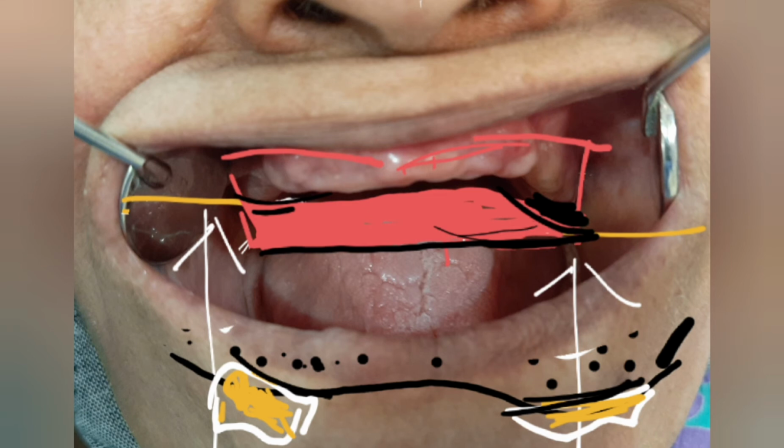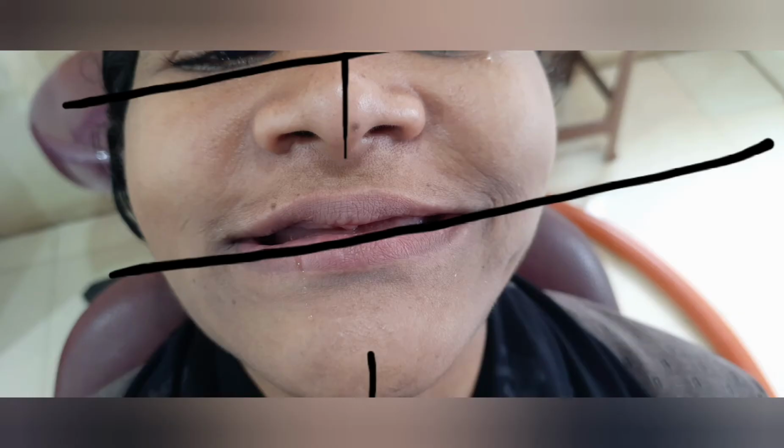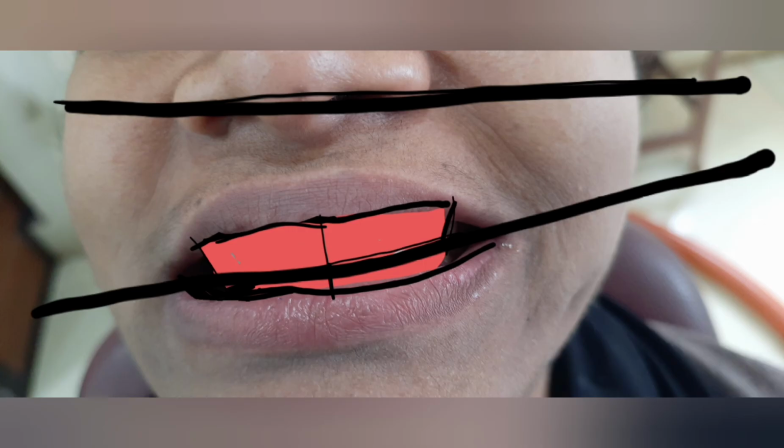The horizontal plane has to be followed. In severe cases, the rim on one side has hardly any wax left while the other side has a sufficient amount of wax. The non-uniformity of the ridges can be from mild, moderate to severe. While placing the waxed up occlusal rim and trying to correct the occlusal plane, most often we end up in a slanting occlusal plane, even after hours of correcting the plane with a hot plate spatula.